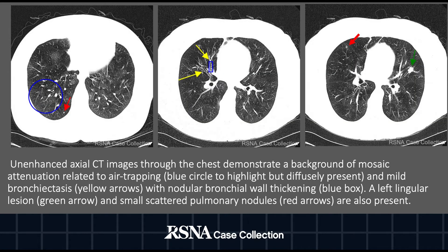Here we have unenhanced axial CT images through the chest, which demonstrate a background of mosaic attenuation related to air trapping, demarcated by the blue circle here. Additionally, there is mild bronchiectasis with nodular bronchial wall thickening, highlighted by the blue box here. A left lingular lesion, demarcated by the green arrow, is also demonstrated with a background of small scattered pulmonary nodules, demarcated by the red arrow.